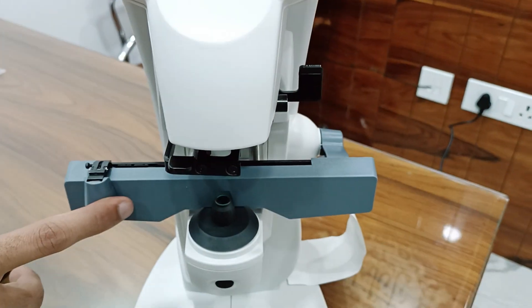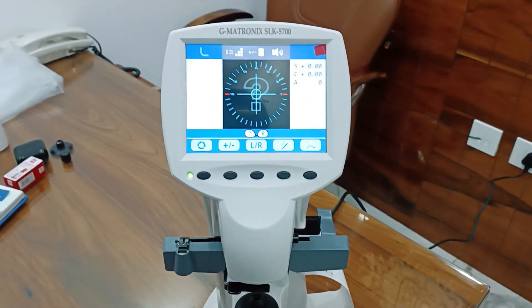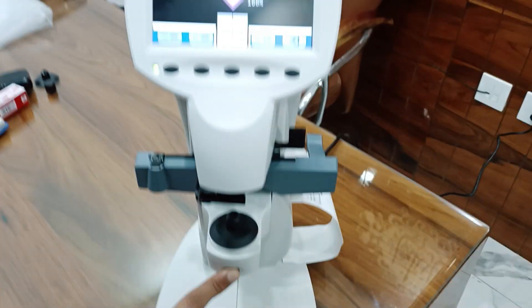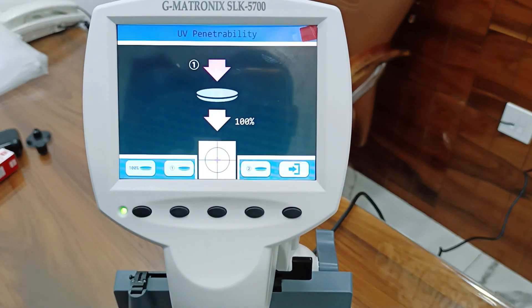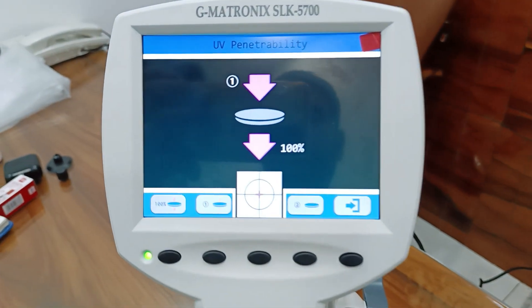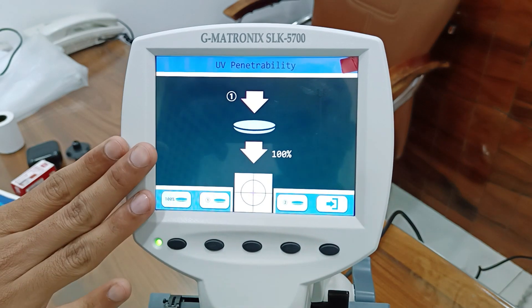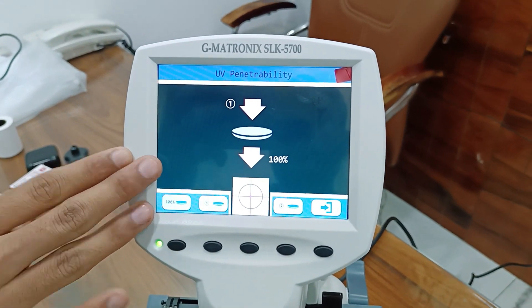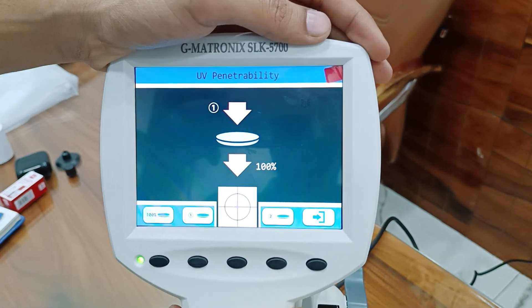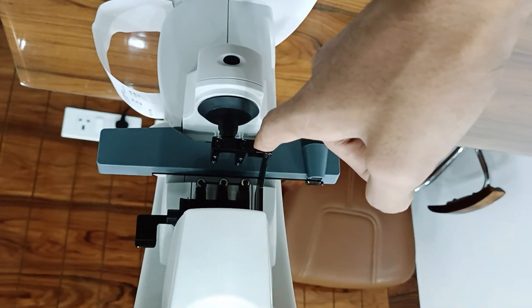You can measure UV protection — ultraviolet radiation — by using the reading switch. Press the reading switch for two seconds and you will be measuring. If it shows 100%, it means the UV protection amount is not available in the lens — 100% UV is passing through. If it shows 85%, it means your lens has only 15% UV protection.